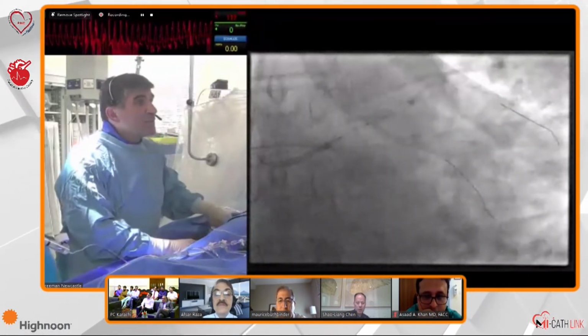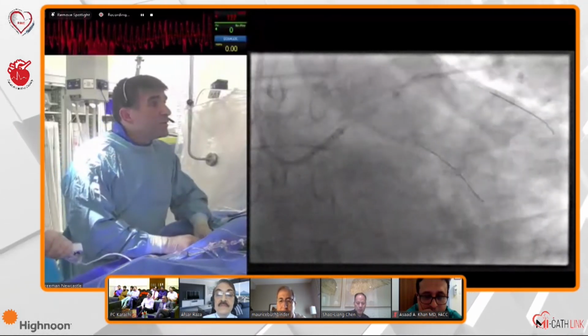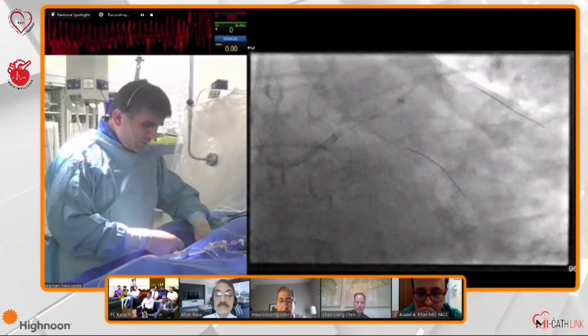See, this is the problem with the angiosculpt. They are a bit bulky. And now with the 2 wires, I can't deliver it into the LAD. If it doesn't go, I'll take a normal 3.5 by 15 or 20 non-compliant balloon.